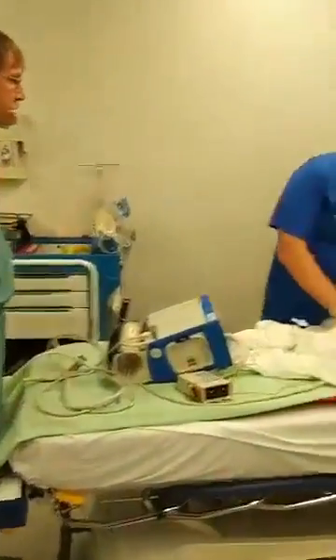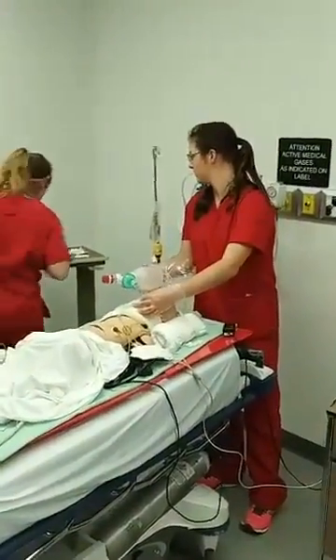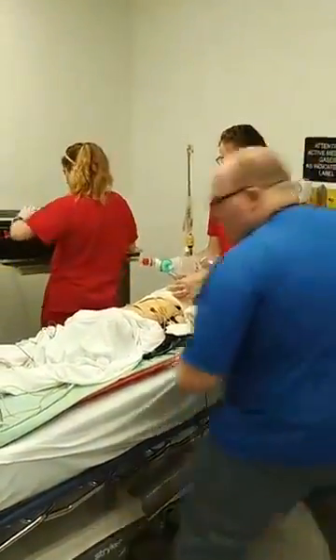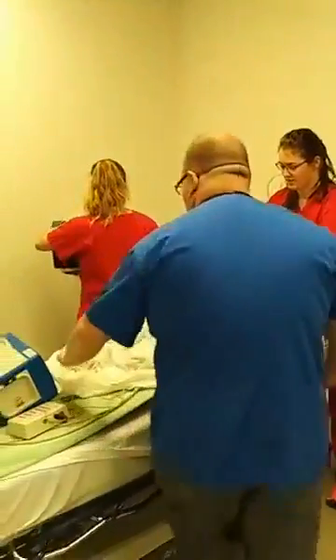You switched over to here. Yeah. Okay, you got the scan box, you put all the stuff in there? Yeah, I got it. Airway equipment? Yeah. I got it. Good. Okay, monitor's hooked up. Okay. So what have we not done for a while yet? We haven't reassessed. Okay, reassess.